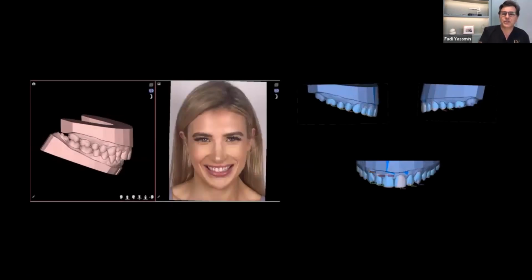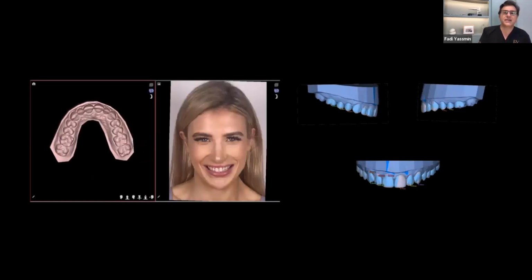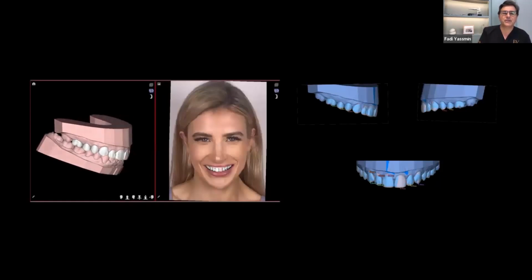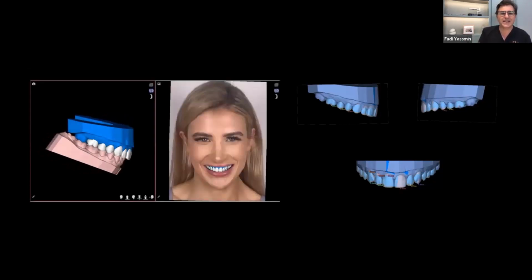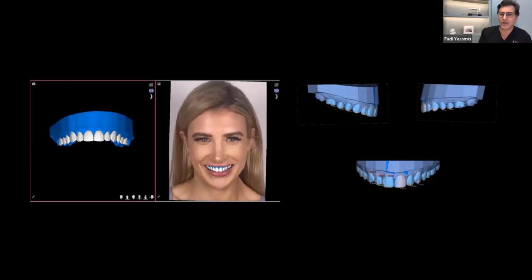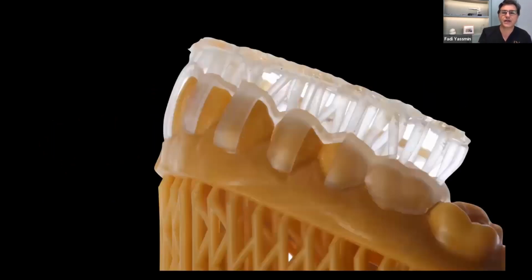It's very important to digitize the patient because, as you can see, once we've done that, we can start the design process. So we're looking at an ideal treatment. An ideal treatment involves facially driven design, gingival proportions, tick, tick, tick of all those smile parameters that we were discussing. And once that's done, we then have the blueprint, the template, to show the patient, test drive, as we call it, mock-up, whatever you want to call it, so that the patient has a better understanding of what the final outcome is.